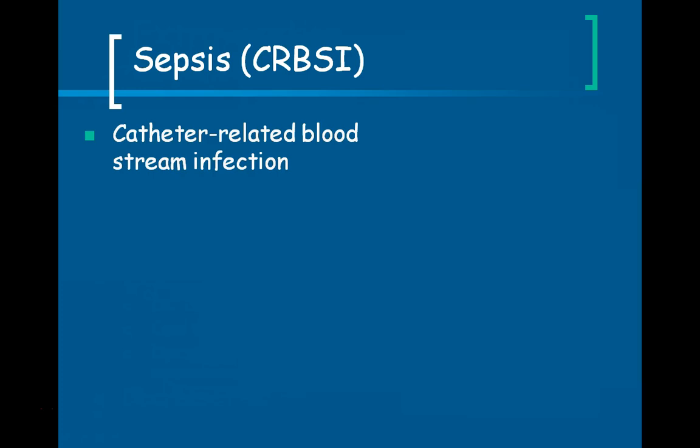They say that the major source of infection, once the cath is inserted, after that point in time, is the hub of the catheter tubing, so the rubber hubs or the Y sites. And so we have to be very careful each time we access those Y sites because we're risking introducing organisms. So scrubbing the hub is crucial. Scrubbing the hub for at least 10 to 15 seconds with good friction, and keeping the ends of the tubing sterile if we disconnect them.